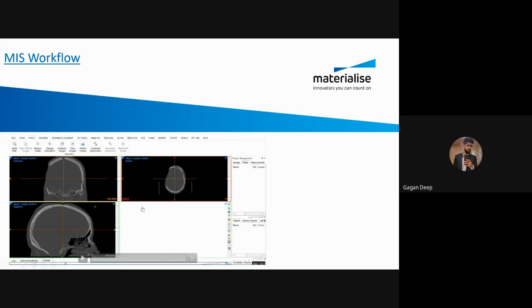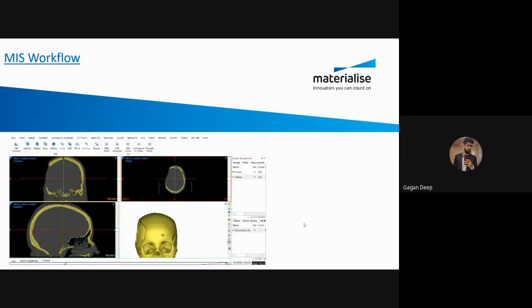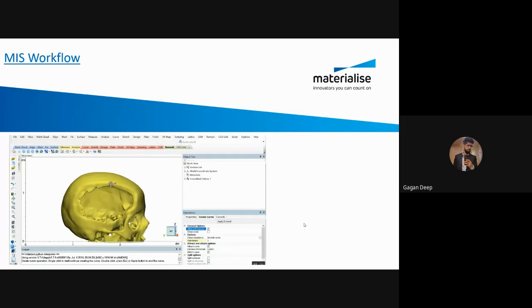So there is a small workflow of how to design a customized cranial plate using Mimics software. The process basically starts with the conversion of the 2D model into 3D. You can also do some post-processing like smoothing, because for a patient-specific implant, you need a smooth structure. Those things are possible here. As you can see, this is the 3MATIC software. Once the conversion is done, you can import it into 3MATIC, where you can design the implant.